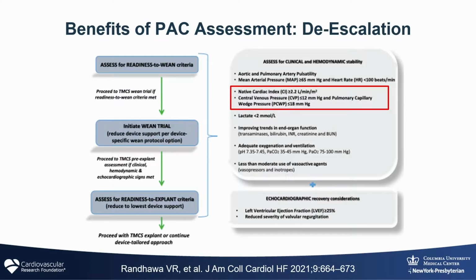And ultimately, we talked a little bit about weaning protocols, but this can be really, really useful to determine weaning. But you can't hold your hat to the numbers alone, because if you do, you're not going to wean patients who are absolutely weanable. You have to use this as a tool in the clinical armamentarium as a whole.